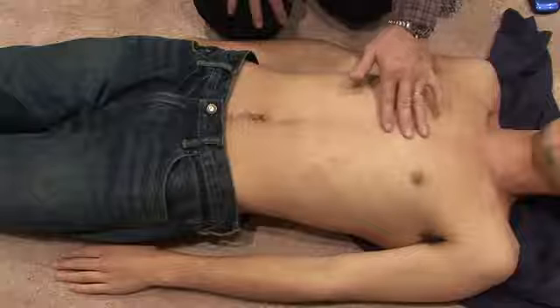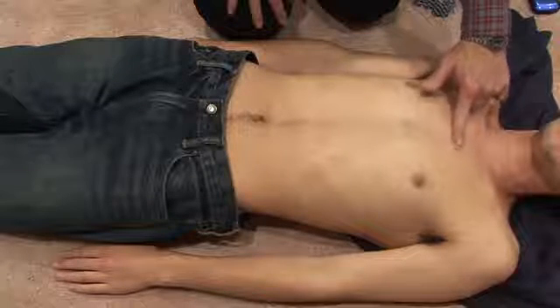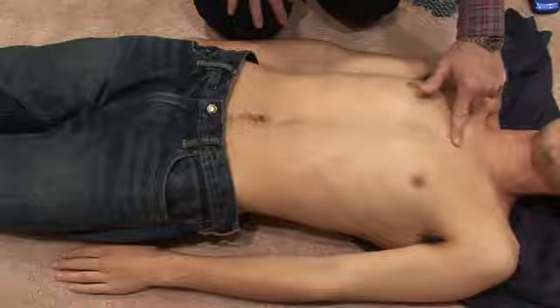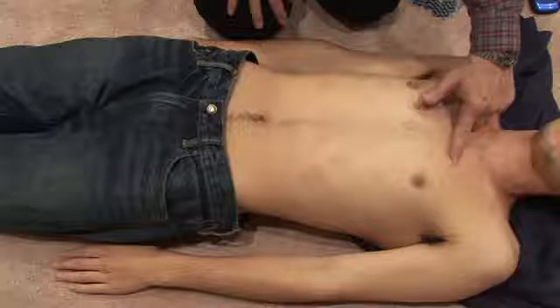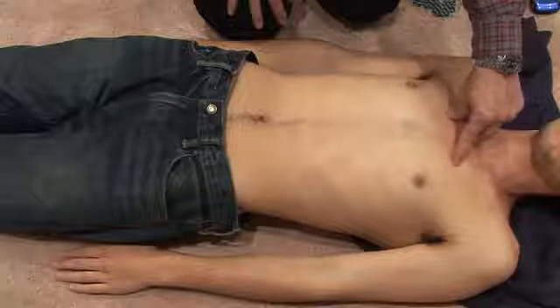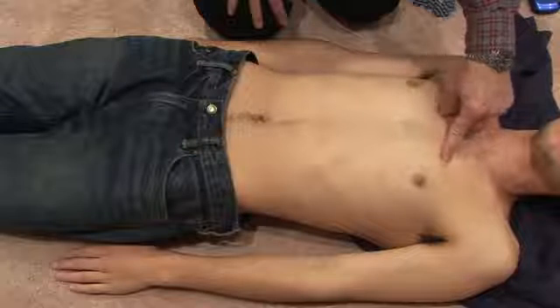Now, between the body of the sternum and the manubrium, there forms an angle. It's called the sternal angle. It's a ridge. If you run your finger along the sternum, you can feel this ridge. Now, this ridge, if you follow it to the left and the right, it actually connects with the second rib. And that's important because below the second rib is the second intercostal space.